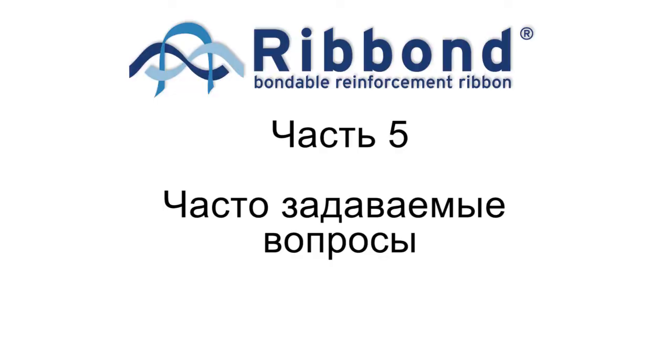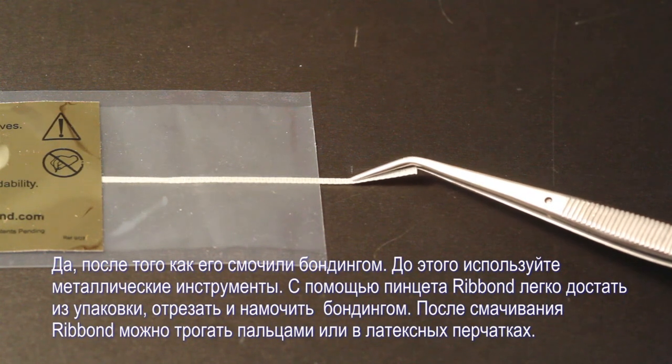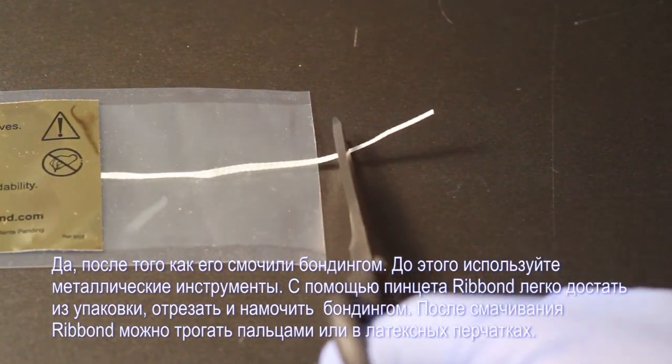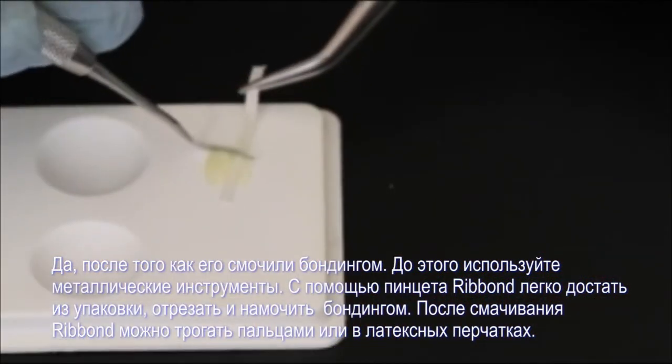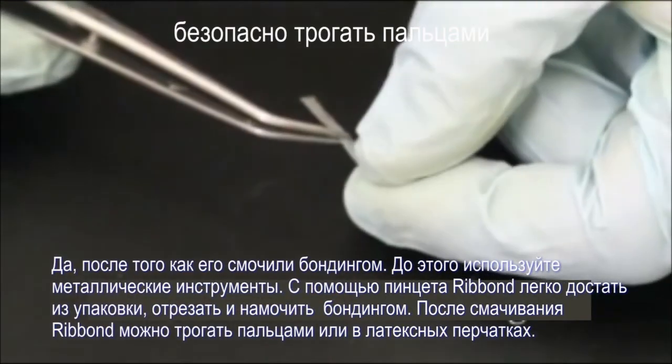Commonly asked questions: Can I touch Ribbon? Yes, after it is wetted with resin. Before it is wetted with resin, use metal instruments to manipulate the Ribbon. It takes no coordination to remove the Ribbon from its packaging with tweezers, cut it, and wet it with resin. Once it is wetted, you can touch the Ribbon with your fingers or latex gloves.